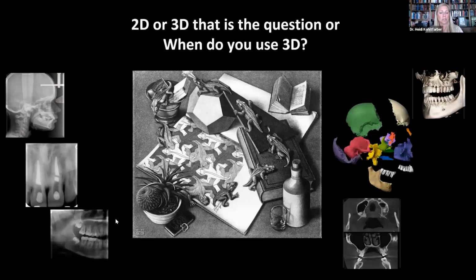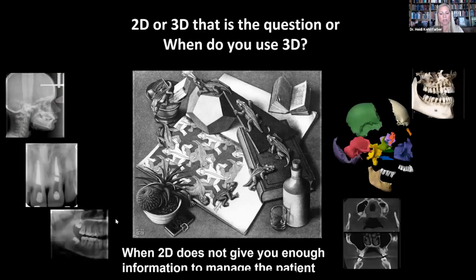All right. So 2D or 3D, when do you go into 3D? And it really is any time that 2D does not give you enough information. If you're looking at the 2D, patient's in pain, you're not sure exactly what's going on, feel free to go ahead and move into 3D. That is your justification.